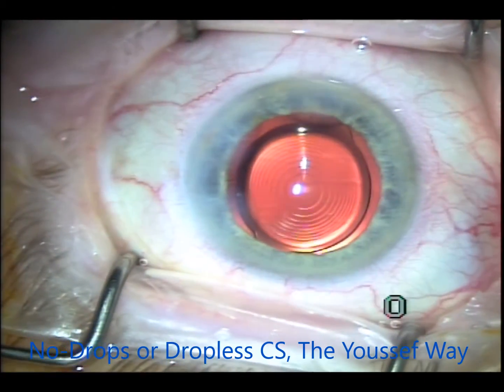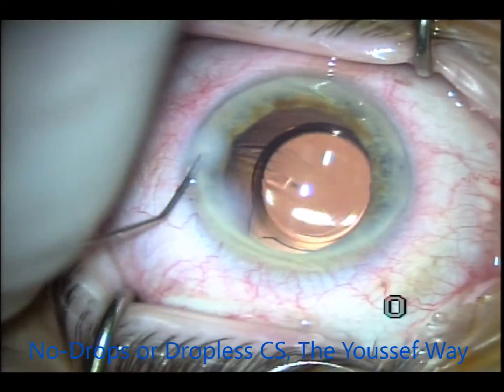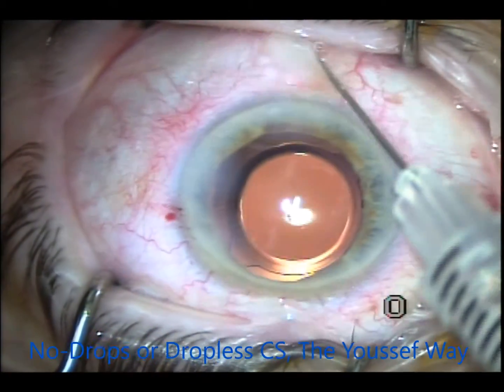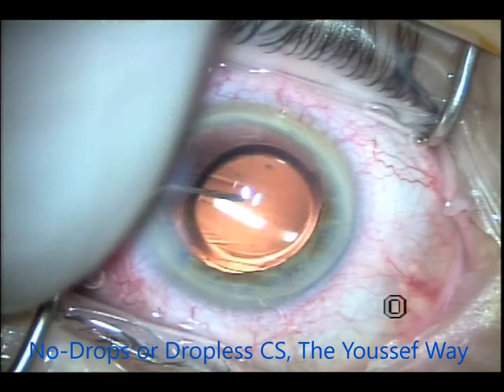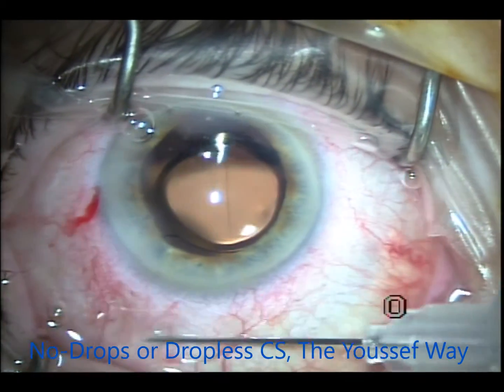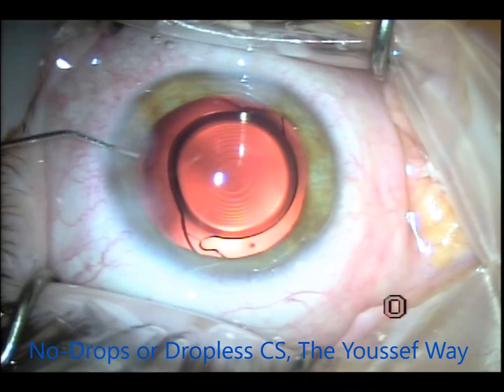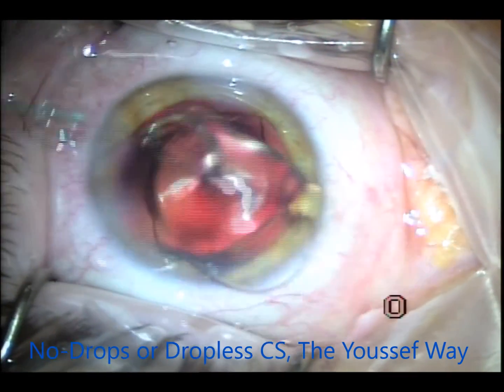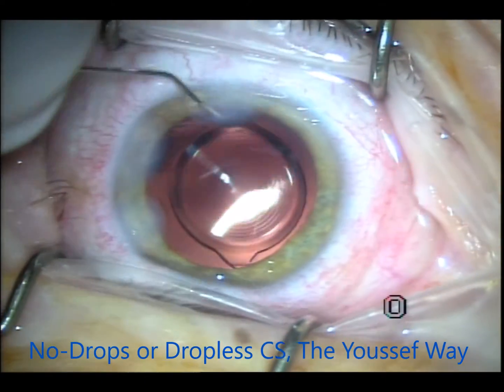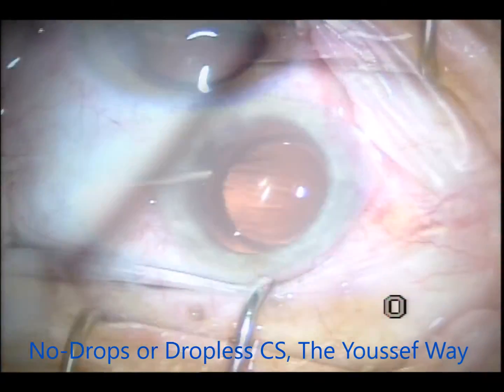Compliance is absolutely great because patients don't have to remember to bring the drops. Another patient — again we hydrate the wound, inject behind, replace everything with moxifloxacin inside, and inject the Tri-Moxie subconjunctivally. The amount of Tri-Moxie injected is about 0.2 to 0.3 ml. A few more cases — a lot of my lenses are Symphony lenses, which I love very much to correct close-up vision in addition to distance vision.